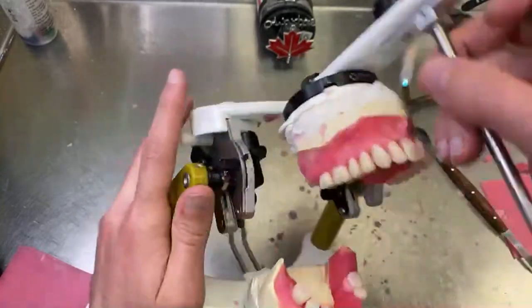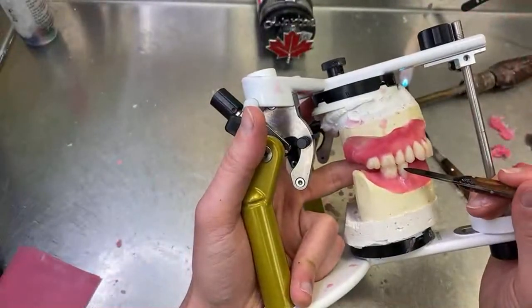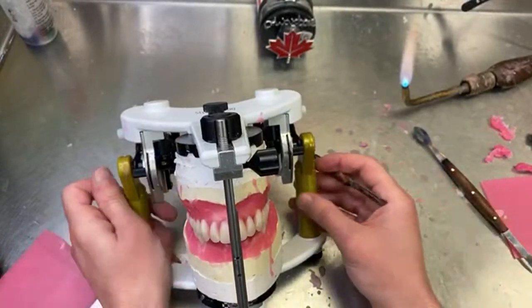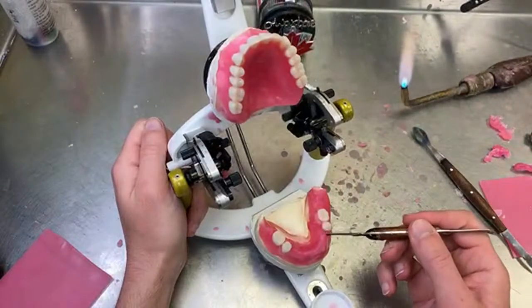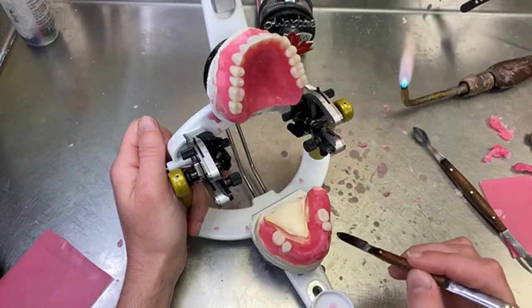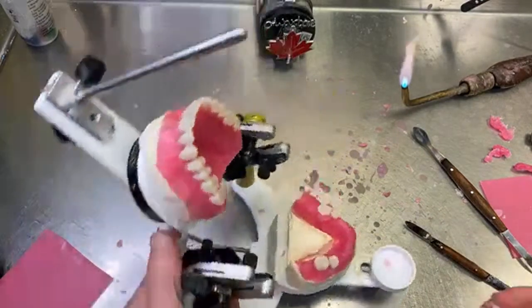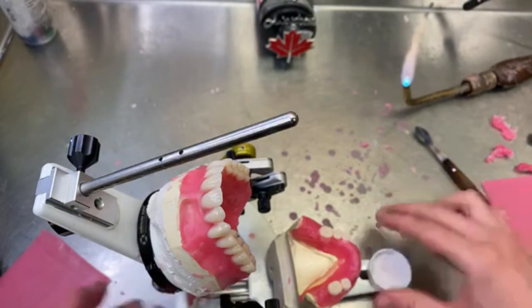This needs rotation a little bit. I'll do that in the tweaking after. Diastema, we asked the patient, do you want a gap in your teeth or not? If they have one in the old denture, we make it. If they have one in their natural teeth and they removed it, we make it if they want. And it goes like that.